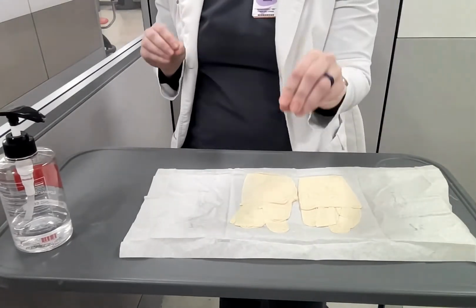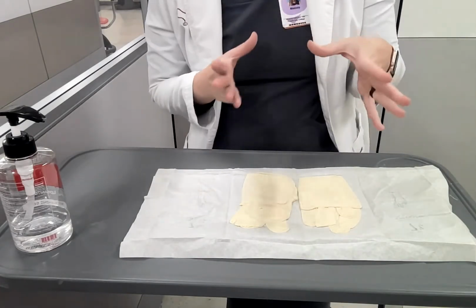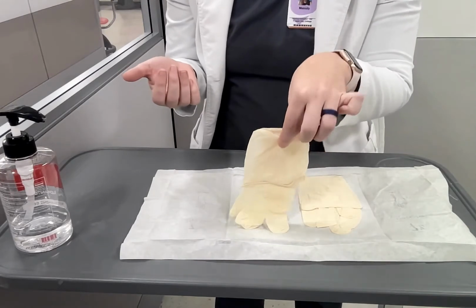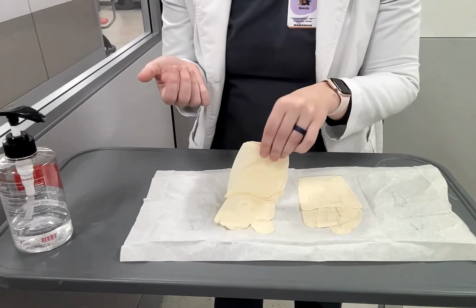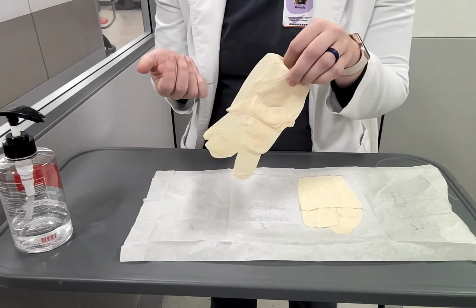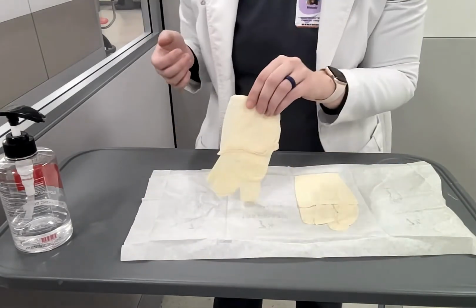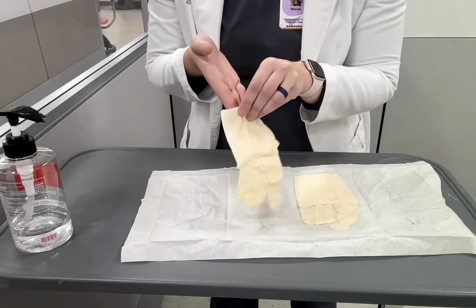I'm going to pick up, you know, your checkoff says dominant hand, non-dominant hand. Okay, that's all fine and whatever. I always put on my right hand first. That is my dominant side. I'm going to pick up the cuff, the edge of the cuff. So my little fingers are inside here. Edge of the cuff. That's the part where your skin is going to be. I don't want to pull it outside of the sterile area, and I don't want to be draped all over the sterile area. So just pick up the cuff. Now I'm going to slip my hand inside.